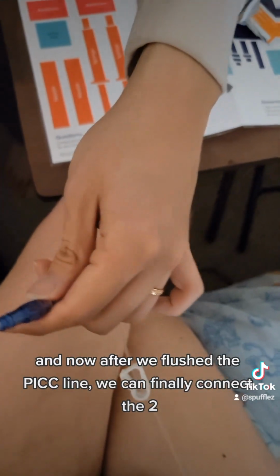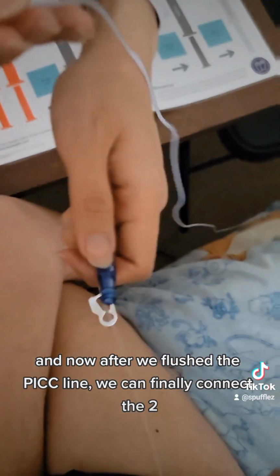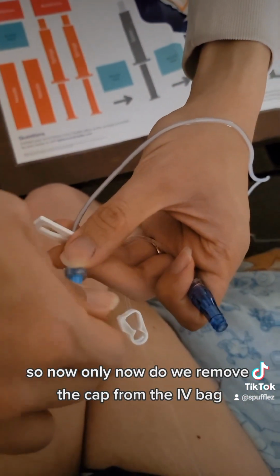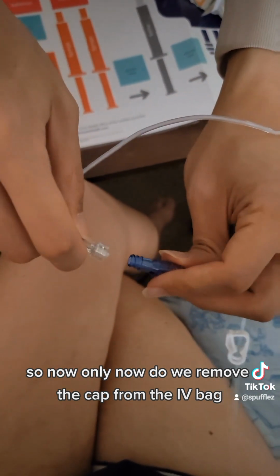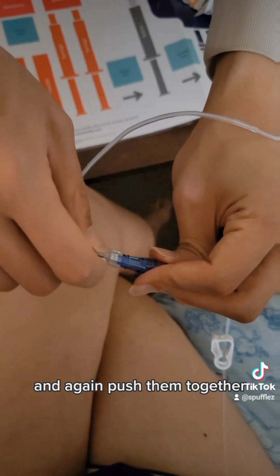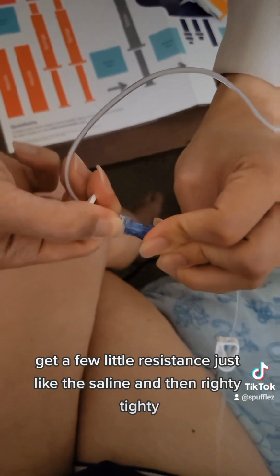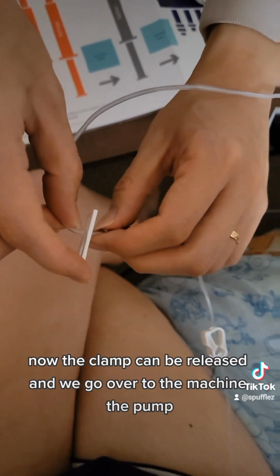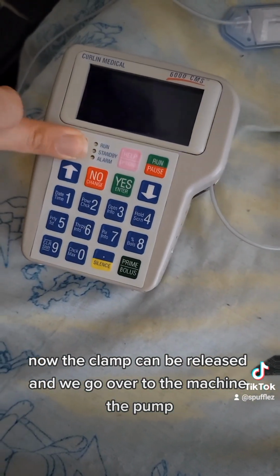And now after we flush the PICC line, we can finally connect the two. So now, only now, do we remove the cap from the IV bag. And again, push them together, you feel a little resistance, just like with the saline, and then righty-tighty. And boom, it's in. Now the clamp can be released, and we go over to the machine. The pump.